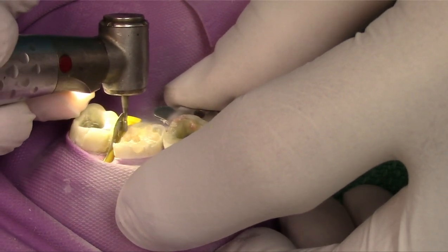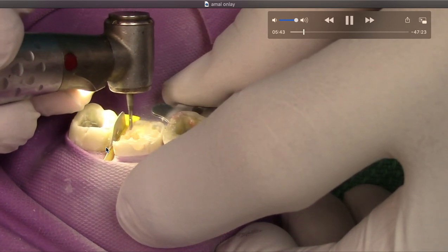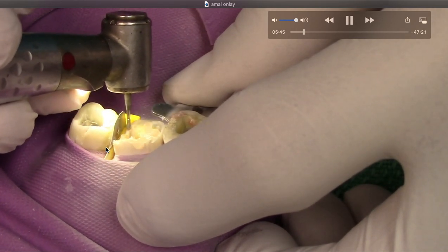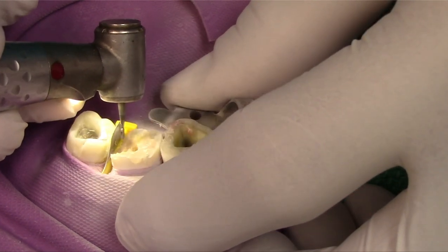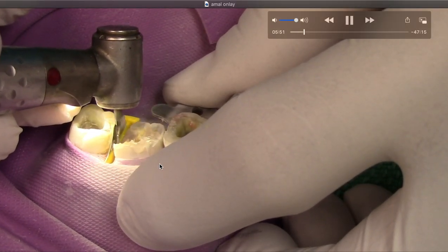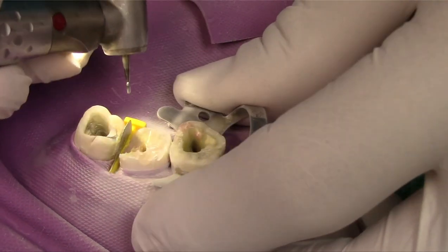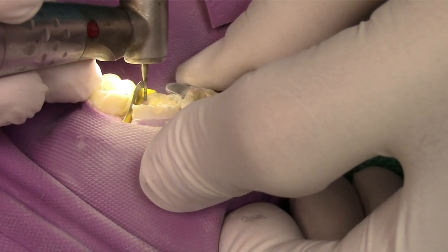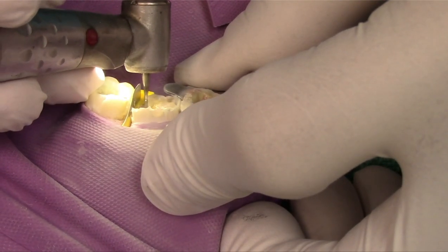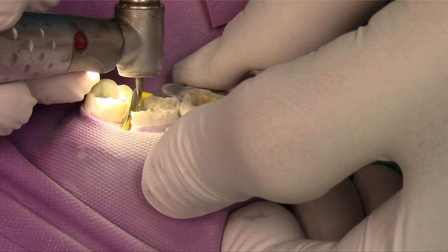On a real life or extracted tooth, the wedge actually speeds up my preparation. I'm removing some of the composite, but I decided it's too much and beyond the scope of what I want to produce in this video. So we're just going to open up around where the composite ends — the margins on the mesial box — and remove the rest of the composite from the access.